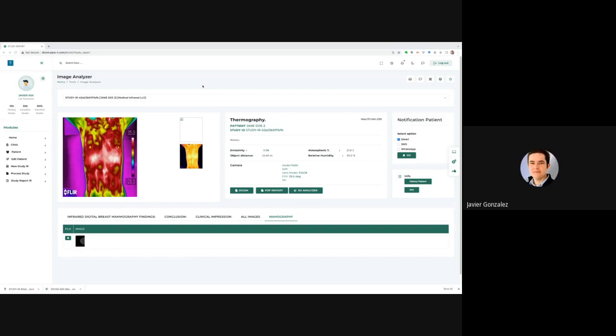Well, the thing is that we were shooting for an all-in-one application, so somebody can just use one application to do everything. If you just want an app to upload images and save them as DICOM files, we can do that, and it's probably easier. Okay. But I think it doesn't seem convenient for somebody to be jumping between different apps or software to do the same thing. If you can do everything on just one platform, I think that's more convenient. I get you. Agreed.